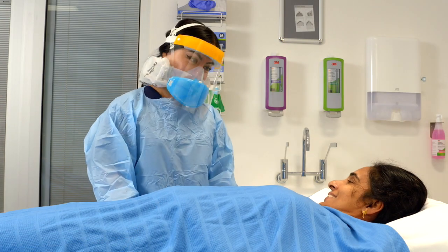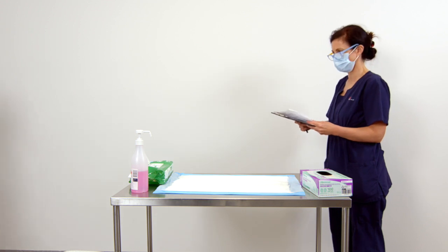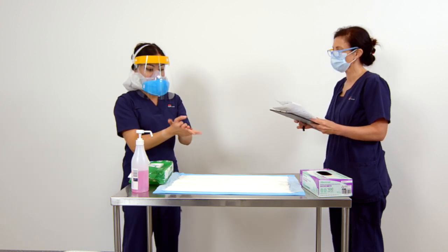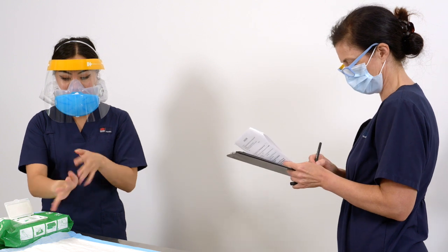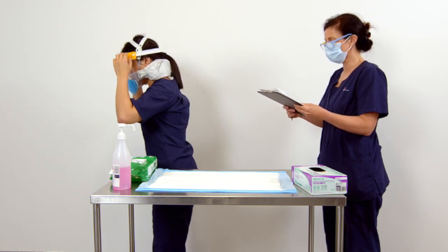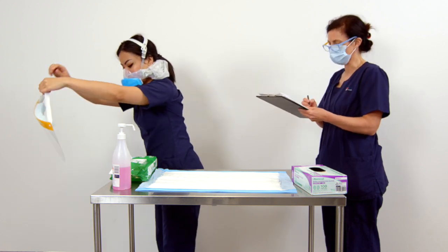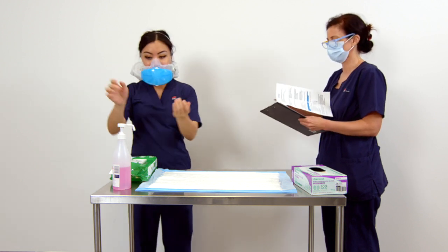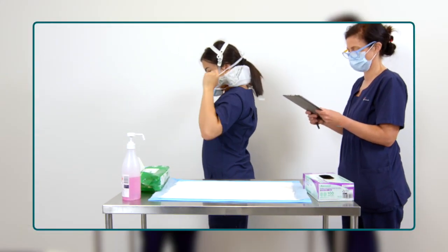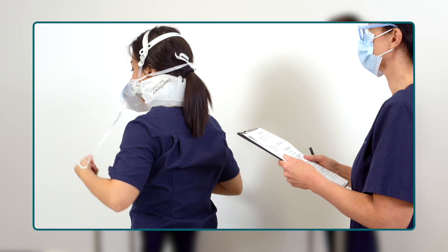When you are ready to exit the patient area, remove the appropriate PPE inside the patient room and exit to the doffing area. You will need a doffing trolley with a disposable fluid-resistant sheet, alcohol-based hand rub, and disposable gloves. To doff the PAPR, first perform hand hygiene. Remove your eye protection — if it is a single-use item, place in the general waste bin; if it is reusable, clean your eye protection before placing in a clean area. Perform hand hygiene. If using a surgical mask, remove it now. Untie the bottom ties first and take care to keep the mask away from you to avoid contamination.